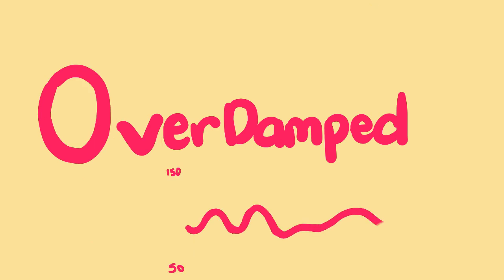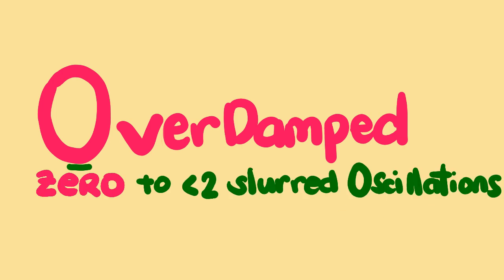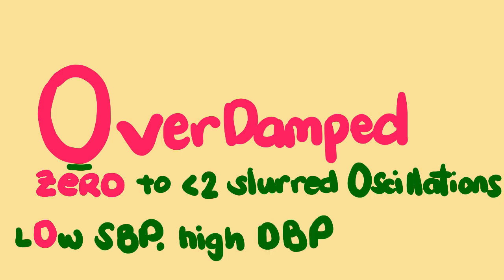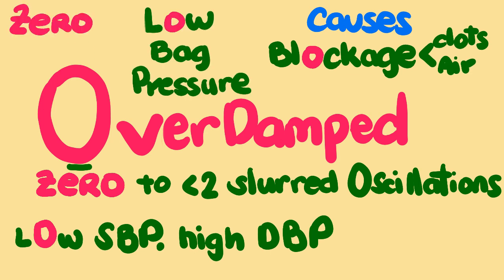On the other hand, the over-damped waveform will have zero oscillations, or less than 2 with slurred details after the square wave test. This will lead to low systolic blood pressure and high diastolic blood pressure. Causes are blockage, such as blood clots or air bubbles, low flush bag pressure, and zero fluid in the flush bag. Noting that in both issues, the MAP remains unaffected.